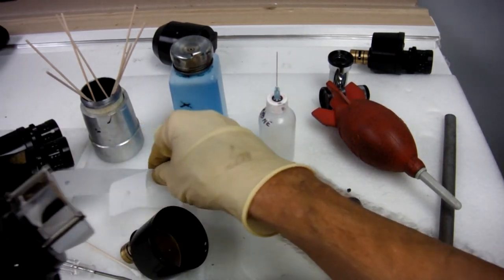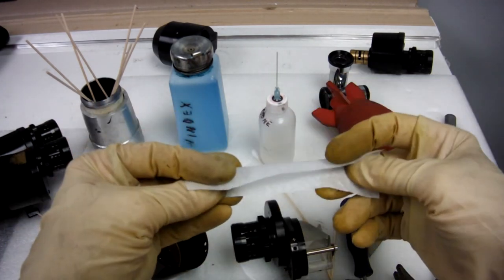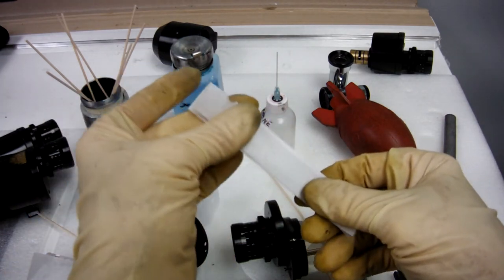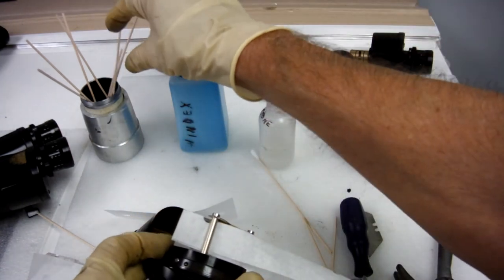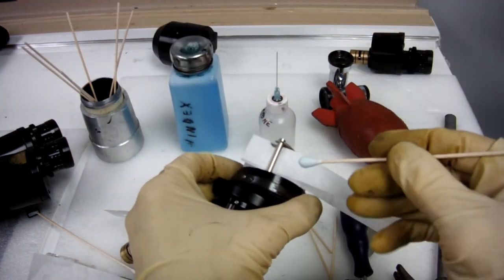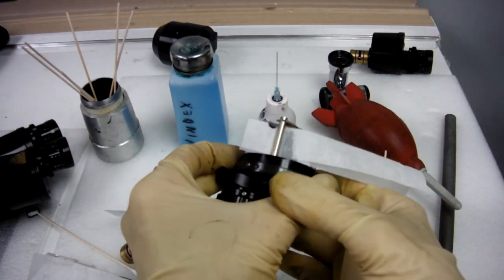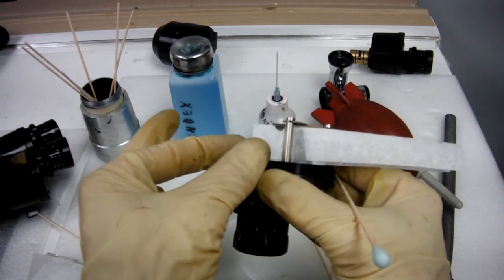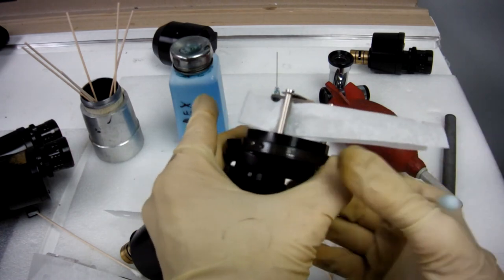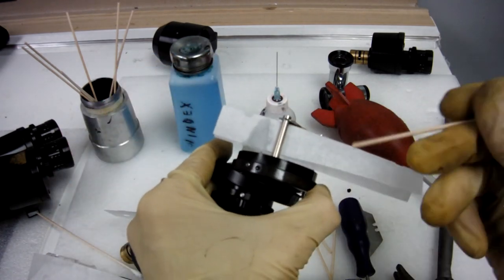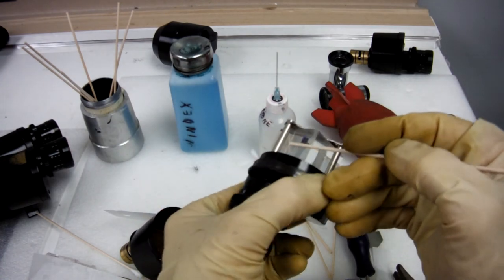One way you can clean underneath those, get a piece of chin rest paper, fold it in half, slide it under the bar, put a little Windex on the paper, and pull it through.